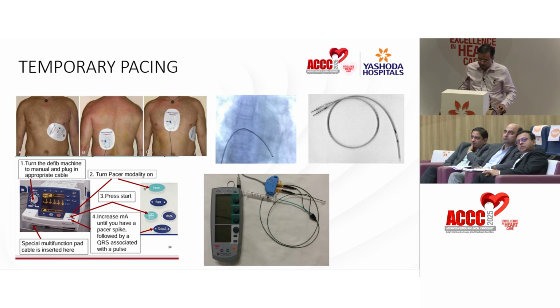The transvenous pacing, of course, with the balloon tip catheters, it should be possible to pace through the jugular without the need for fluoroscopy. The last one, this picture, is actually a transesophageal electrode. Transesophageal pacing is used in children. So we don't have much experience with that. We need a different stimulator for that. So that's a transesophageal electrode.